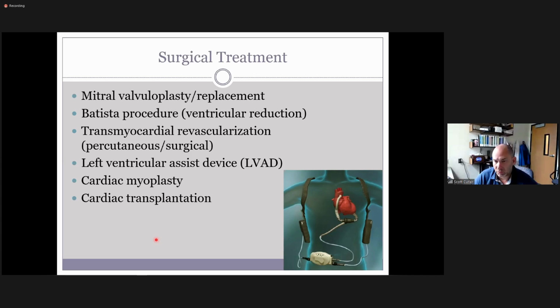But generally speaking, yes, we're going to do the measurements. We're going to look for chamber size, anything that shows chamber size. We're going to measure it in any way we can. So our main ways are parasternal long axis, doing the fractional shortening type of measurement, the Teichholz, doing ejection fractions with Simpson's biplane, taking those volumes. In addition to that, nowadays we're also going to be measuring volumes of the left and right atria, and the right heart. So we would be measuring all four chambers in these situations.